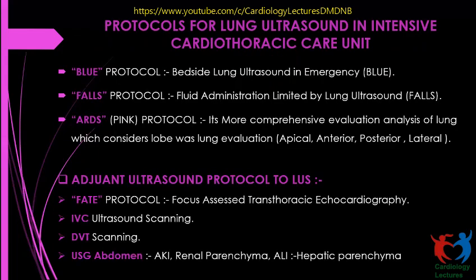The protocols for lung ultrasound in intensive cardiothoracic care units are the BLUE protocol, which is a short form for bedside lung ultrasound in emergency. Then you have the FALLS protocol, which is fluid administration limited by lung ultrasound. You have the ARDS protocol. It is a more comprehensive evaluation and analysis of the lung, which considers the lobar lung evaluation, and it evaluates both lungs in apical, anterior, posterior, and lateral areas. We are not doing this protocol. This may be done by radiologists. They are better at this.